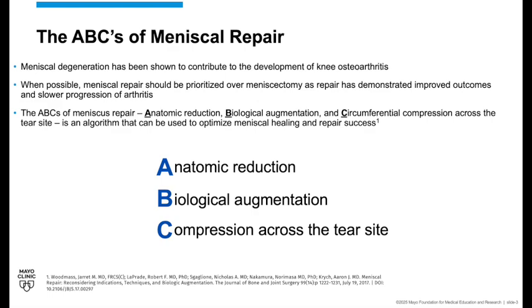In this technique, we propose a novel use of the arthroscopic skid that allows for access to difficult-to-reach peripheral meniscal tears, and how the skid specifically can be used to aid in achieving the A of the ABCs of meniscal repair, anatomic reduction of the tear.